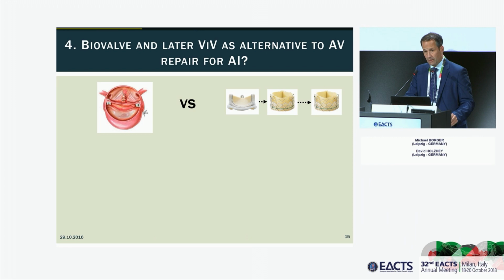But something that you could suggest, and is certainly arguable, is rather than doing a complex bicuspid aortic valve repair, even in Jochen Schäfer's hands, who we all agree is one of the best aortic valve surgeons in the world, even in his hands, the bicuspid aortic valve patients have about a 75% freedom from AI rate over time, which is not quite as good as a prosthesis.